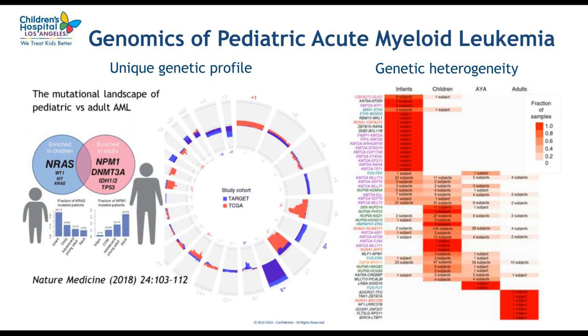And at the same time, while there are all these challenges, the number of markers that are having prognostic significance is constantly increasing. So we want to be more and more efficient in detecting them at the time of diagnosis.